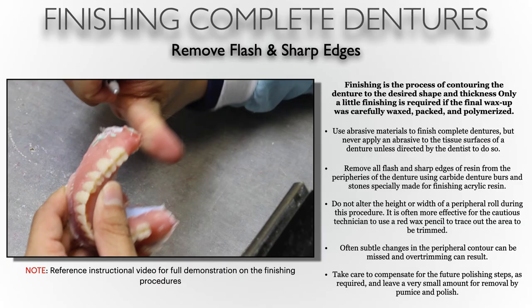Now that we have recovered the complete denture safely from the models, it's time to start removing the flash and sharp edges. It's important to remove the flash first — some of it can be so sharp it could actually cut skin. We want to make sure the dentures are safe to handle. Finishing is a process of contouring the denture base to the desired shape and thickness. Only a little bit of finishing is required if the final wax up was done properly and packing and processing were also done correctly.